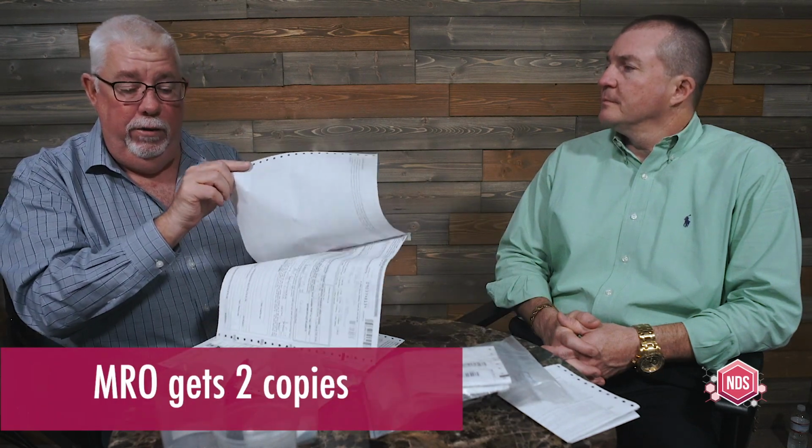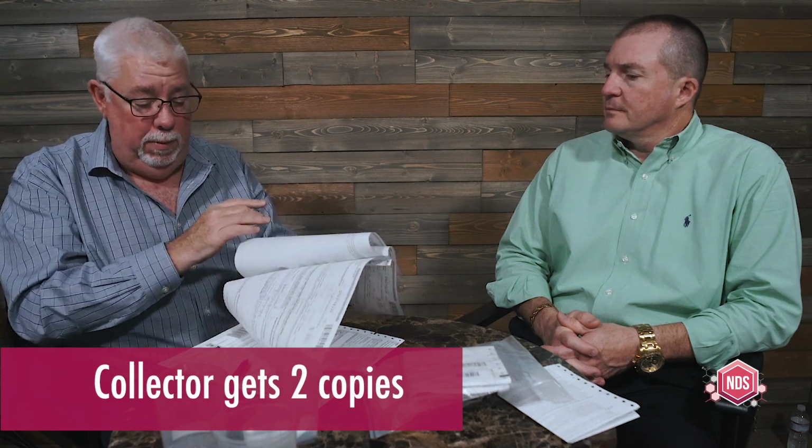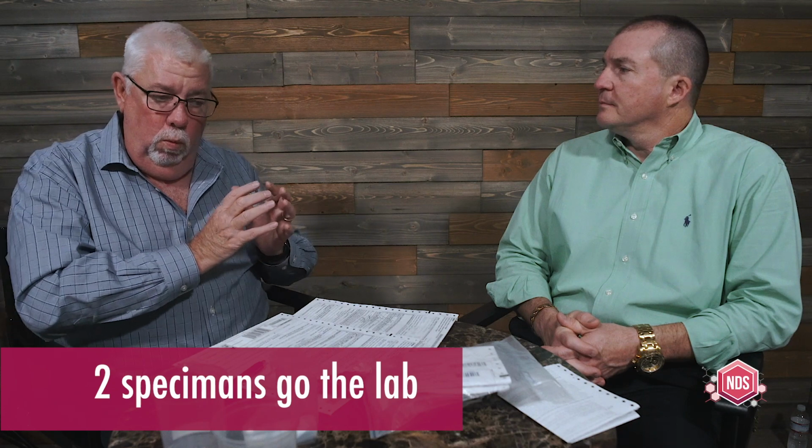I would take both sets of copies. MRO is going to get 2 copies. Collector, my records, I'm going to keep 2 copies. And the employer is going to get 2 copies. So 2 specimens are going to the lab. 1 is the out of range specimen. 1 is the in range specimen. That's going to be the test of record, the one that's in range.